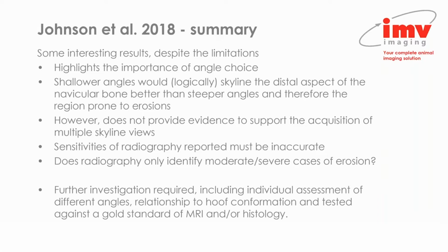However, there is no evidence to support that the acquisition of multiple skyline views is any better than one well-positioned skyline view. Further, the sensitivities of radiography reported have to be inaccurate because they were tested against an inappropriate gold standard. And we have to ask the question, does radiography only potentially identify moderate or severe cases of erosive lesions? I think it's quite likely that radiography does miss the vast majority of mild lesions.